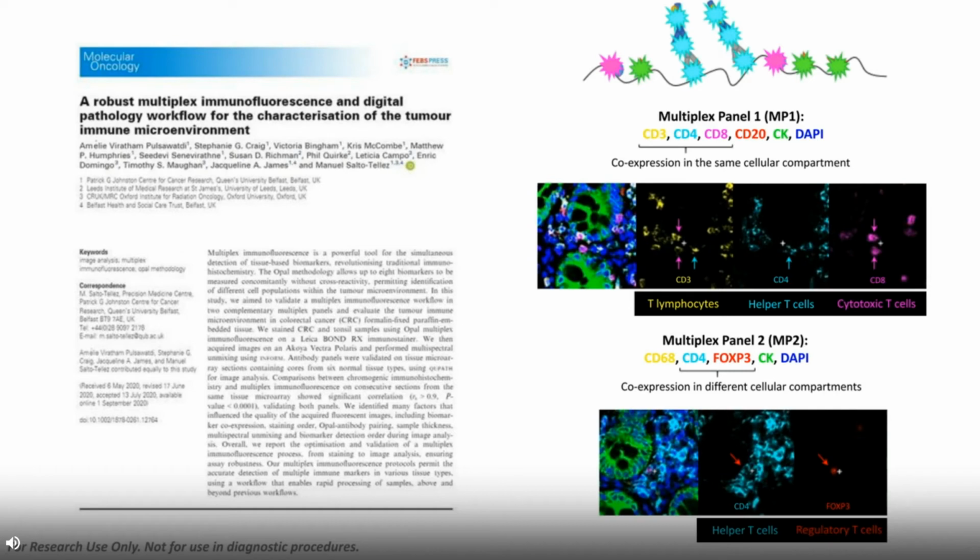So for this assessment, we were talking about using repeated rounds of staining. I mentioned earlier that antigen retrieval is a very important step to consider with the staining process. The reason is that whenever we formalin fix tissue, which is what we tend to use for histological research, we create these protein crosslinks in the tissue. And in order to allow our antibodies to bind to the tissue, we have to unmask them using heat-induced epitope retrieval.